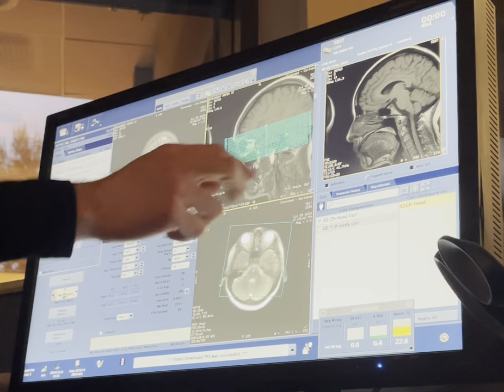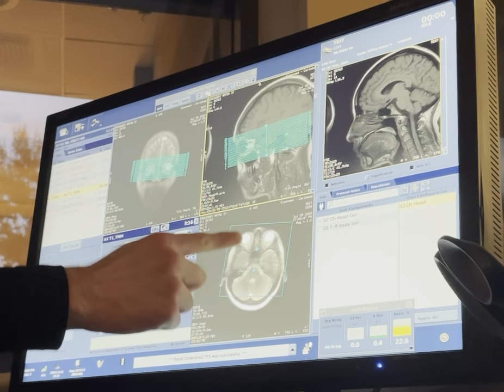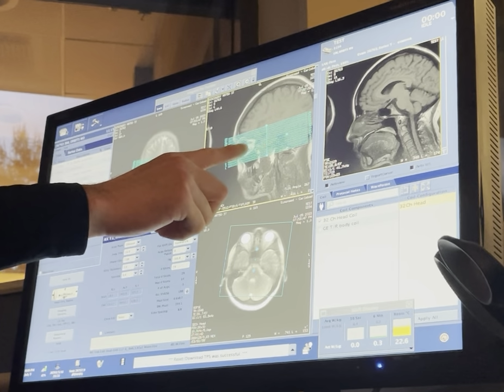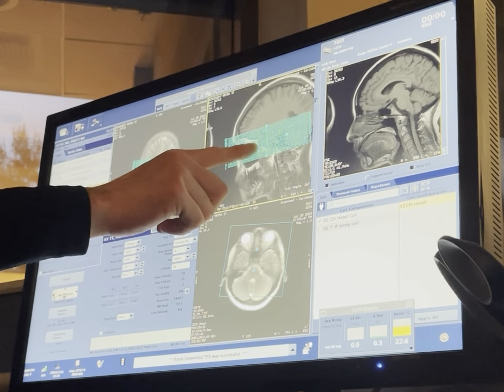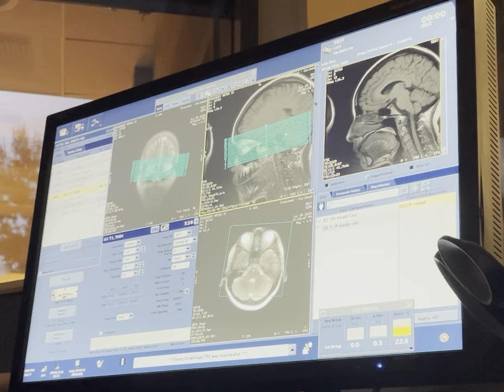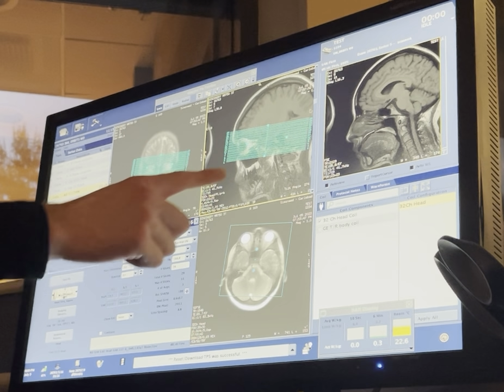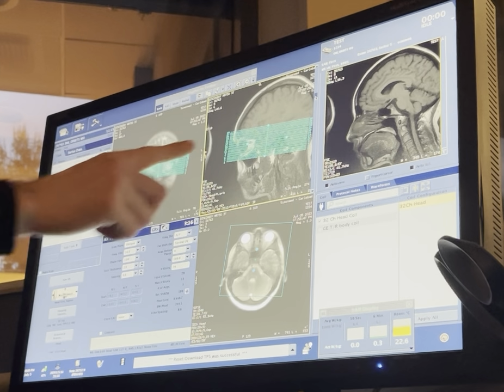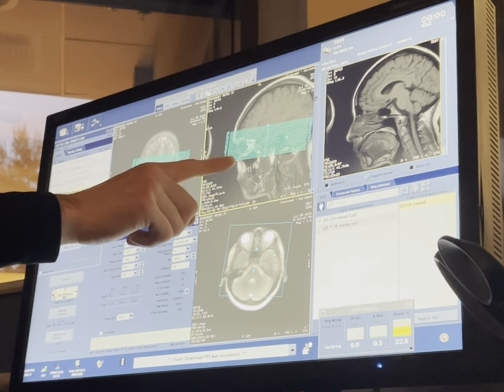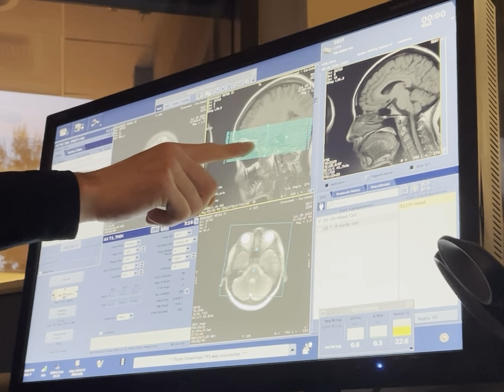So as you scroll, it's gonna move because it's coming in that way and your slices are straight. So it's gonna kind of move. So scroll through, scroll down, you can follow it. That's it. So I would go back and angle between those two slices. Try to angle with that optic nerve. So angle more. Something like that, I'd say. Now scroll up. Yeah, that looks good to me. Now scroll back and forth, down and up. Yeah, you see how you kind of get it right there?